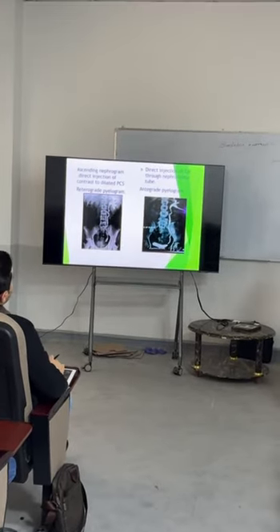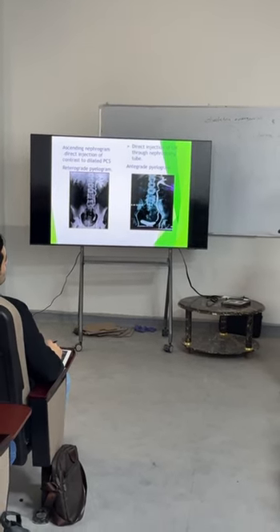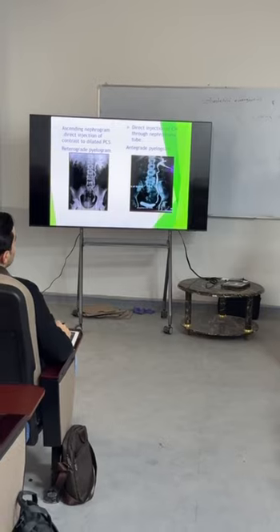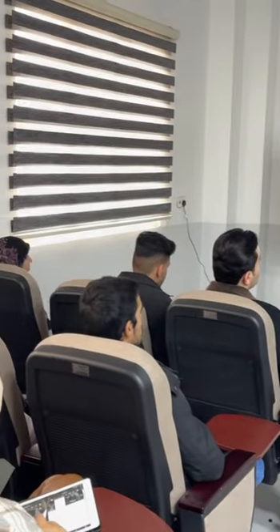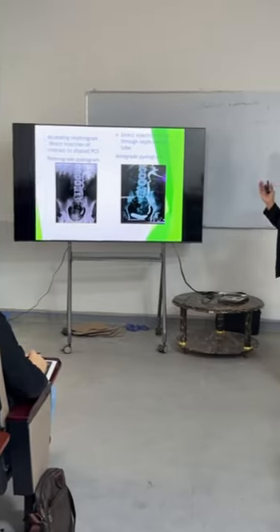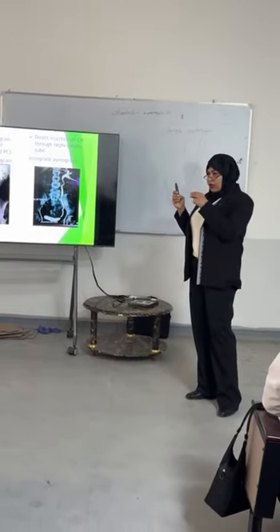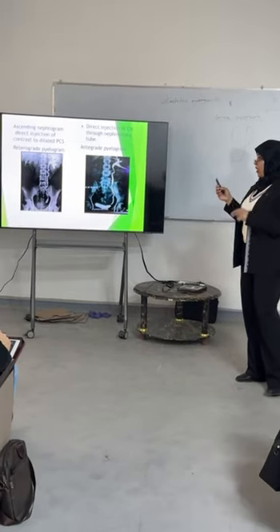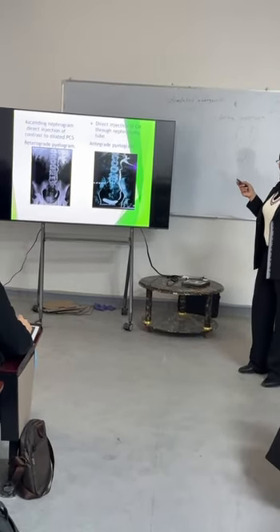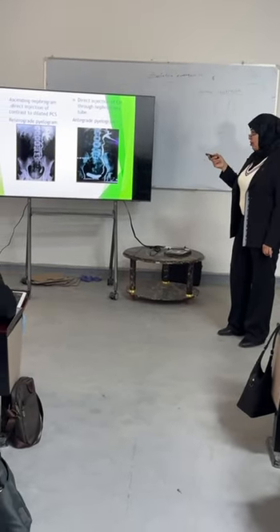So we go to antegrade pyelogram and retrograde pyelogram, the direct study. The IVU is for function, because the dye passes through the blood and then to the tissue to measure the function of the kidney, while this is just for anatomical purposes, because it is direct injection into the passages.